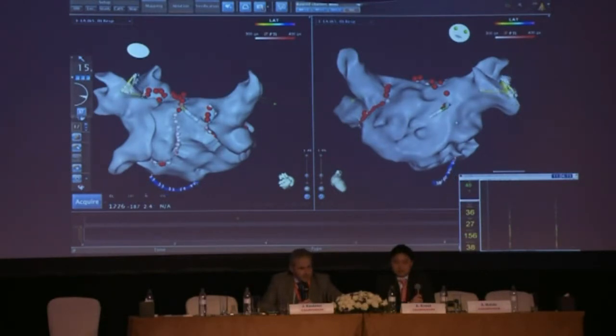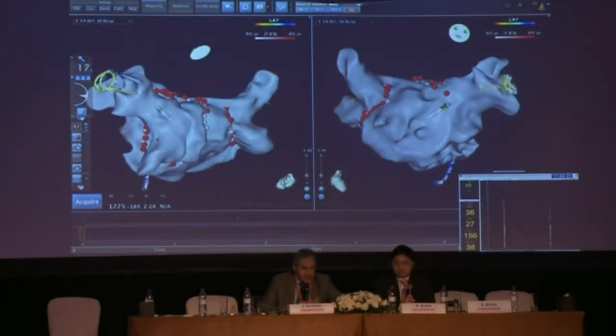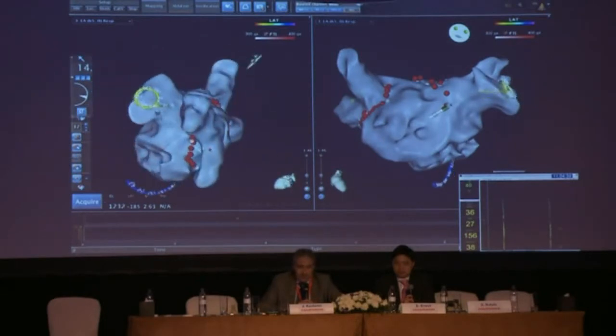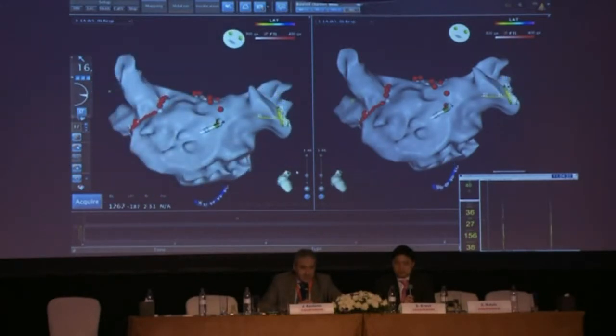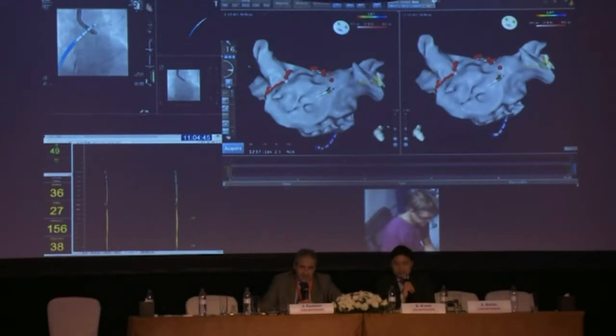I think you notice that if you use what we call farmer's wisdom, and you observe phenomena, usually you see a lot of things. If you are only dependent on technology, you like that technology too much, you can just talk about technology, but you don't have such good success sometimes. Yeah, there's still a bit of old-fashioned electrophysiology involved, isn't there? I fully agree. That's key actually in the world of mapping, that deep down, we need electrophysiology information.